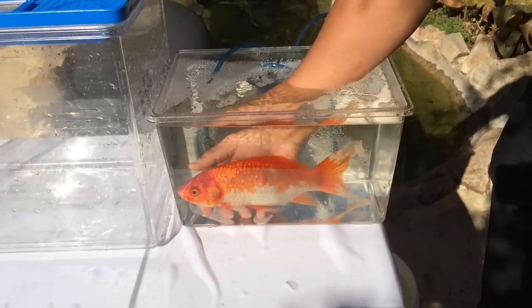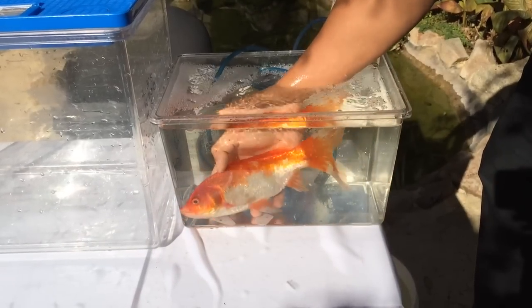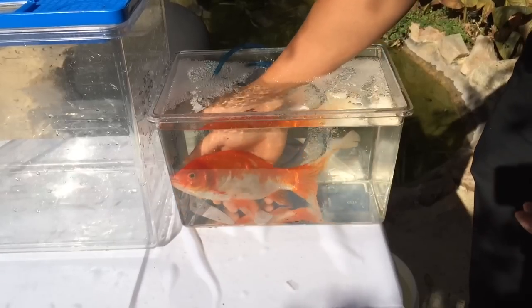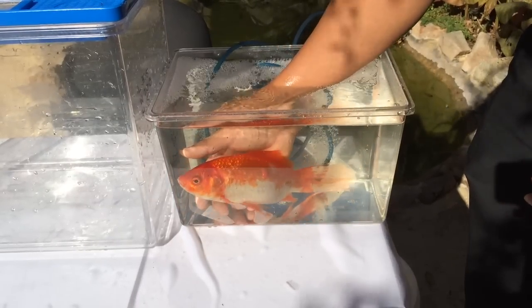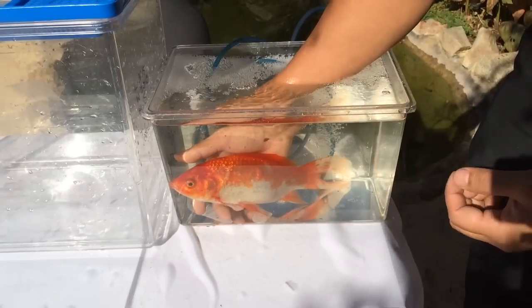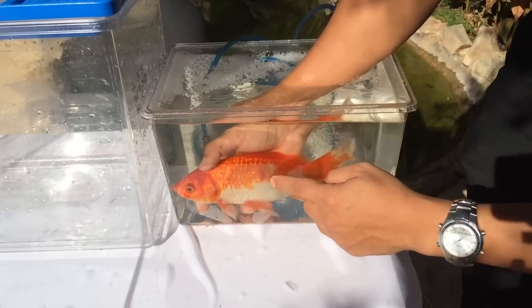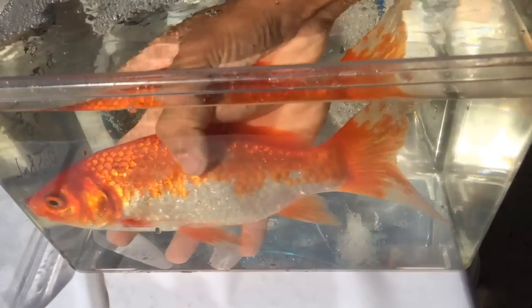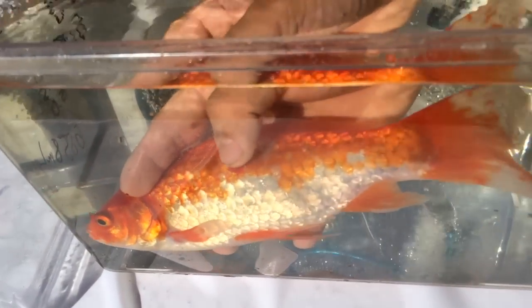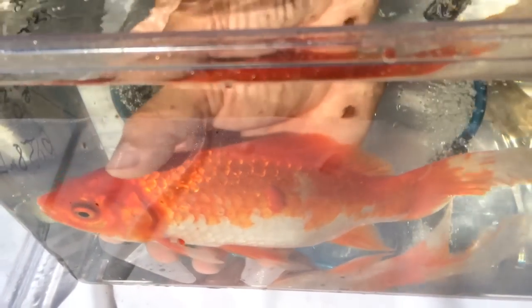So here is Bruce — he's being anesthetized. You can see that he allows handling, which is good for when you're sedating him for handling, but for our purpose we're going to do a fairly painful procedure, so we need him fully knocked out. You can see the tumor here just on this left-hand side — it's a soft lump. Some people describe them as looking like molten candle wax with the same pigment as the fish.